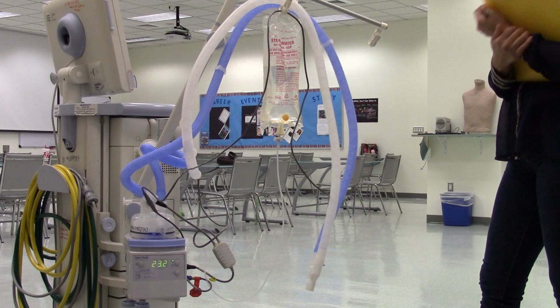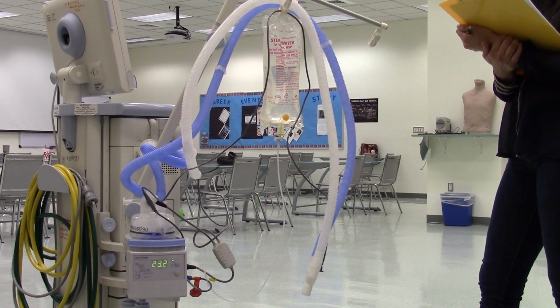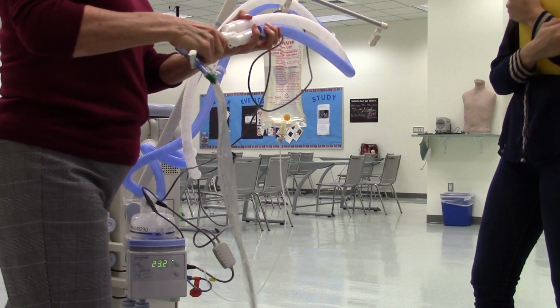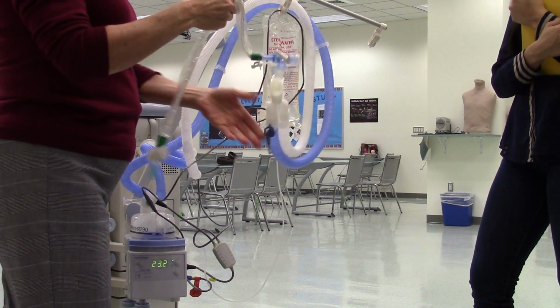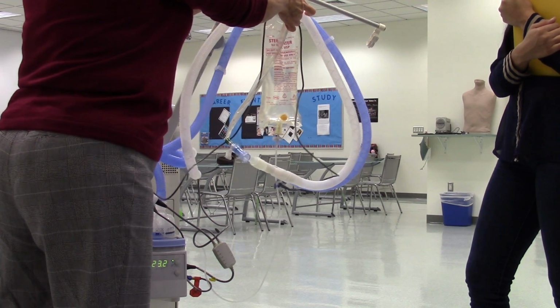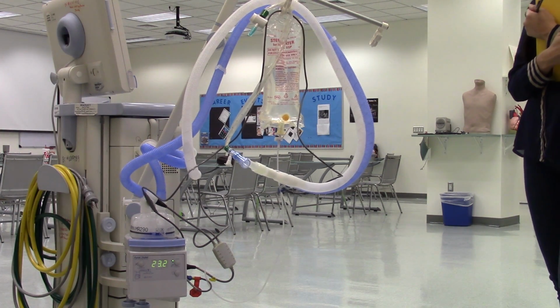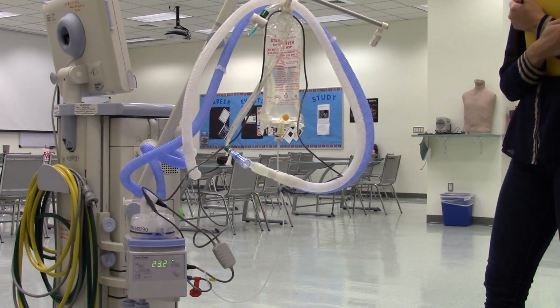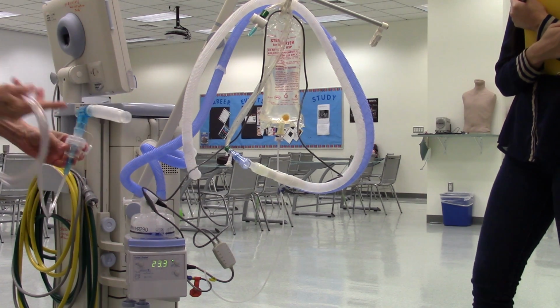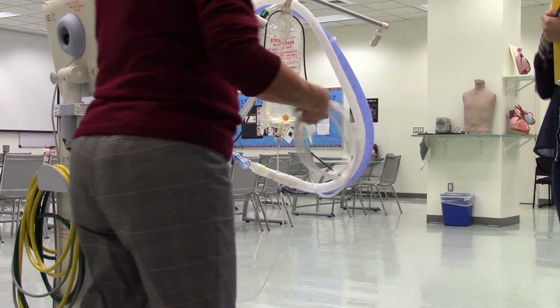So then it says, place a Ballard closed system inline suction catheter into the circuit. Continue reading. Now that the mask is on, adjust the straps, experience what it feels like to have a BiPAP mask on your face. And then it says, place a nebulizer with a T adapter in line with the circuit. I've got my T adapter, it goes in line with the circuit, and I'll put it on the inspiratory side.